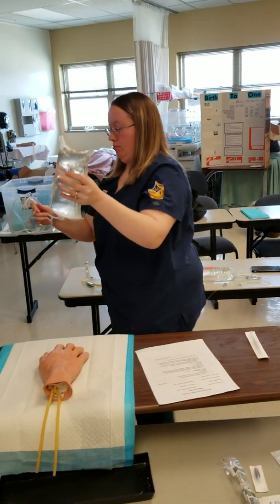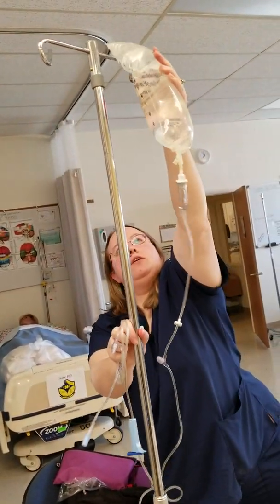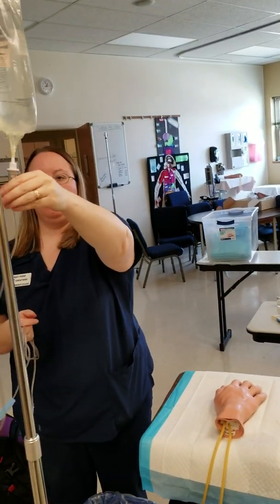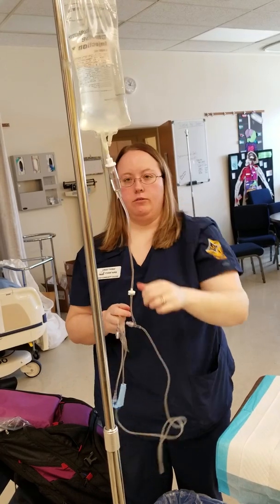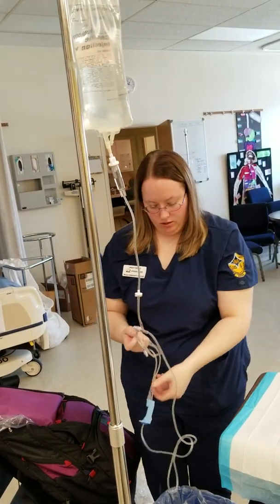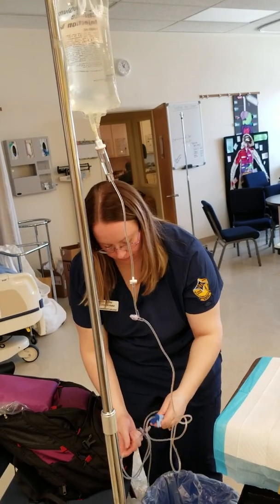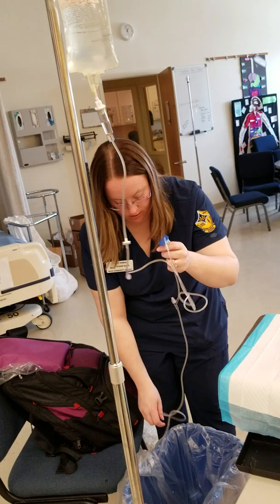I'm going to hang it on the pole over here. Prime my tubing to about half full, and close my lock. I should have closed that in the beginning.